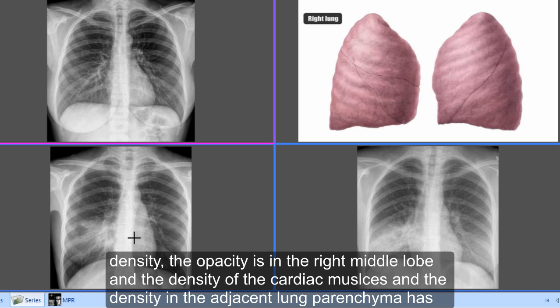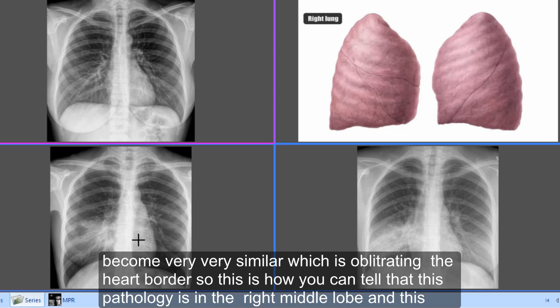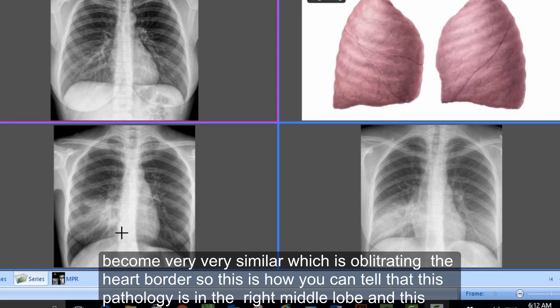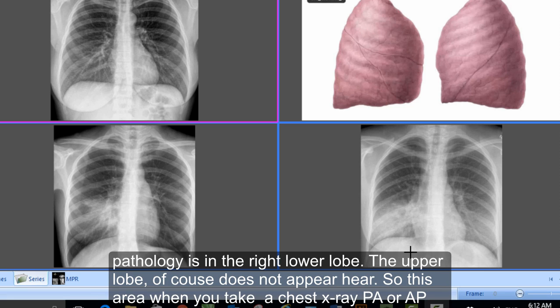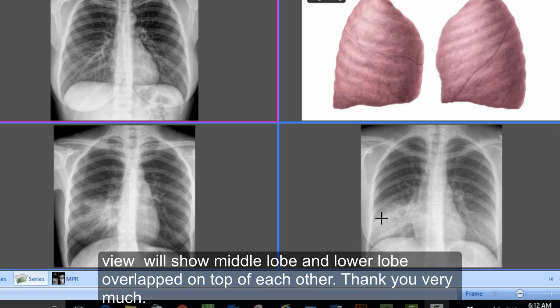The density of the cardiac muscles and the density in the adjacent lung parenchyma have become very similar, obliterating the right heart border. This is how you can tell that this pathology is in the right middle lobe and that pathology is in the right lower lobe. When you take a chest X-ray PA view, the middle lobe and lower lobe will appear on top of each other.